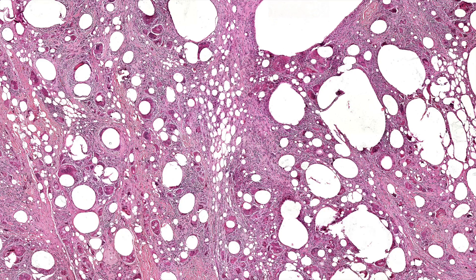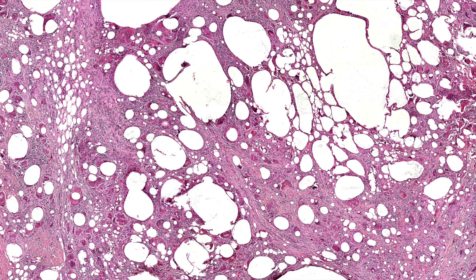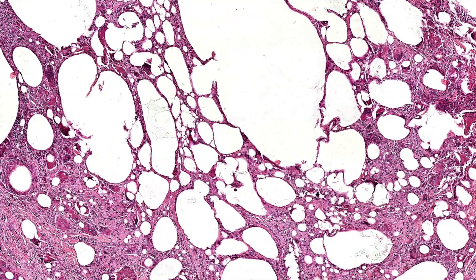There also is actual fat necrosis here. But these big, huge round spaces — they could be like a totally cystic area of lipid — but they basically look like giant fat cells, way too big to be individual fat cells. The key is looking closer and seeing the clear refractile plate-like material. It reminds me of shards of glass, or like bits of clear plastic or plexiglass.